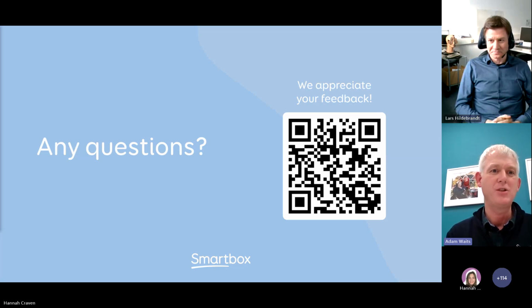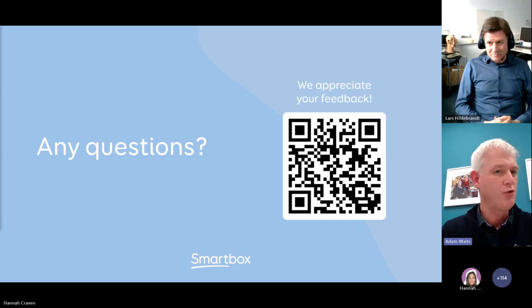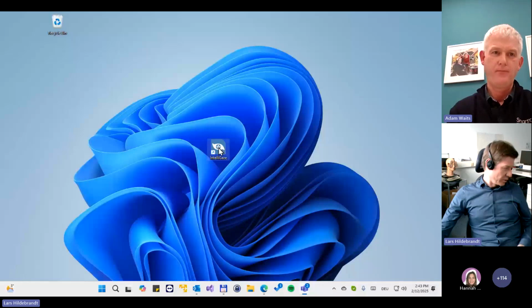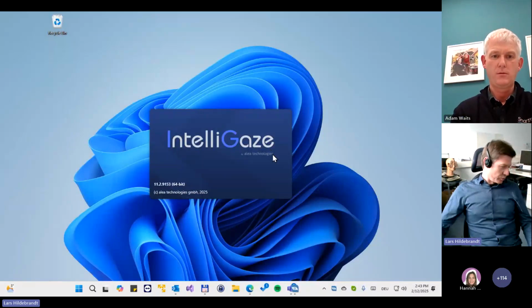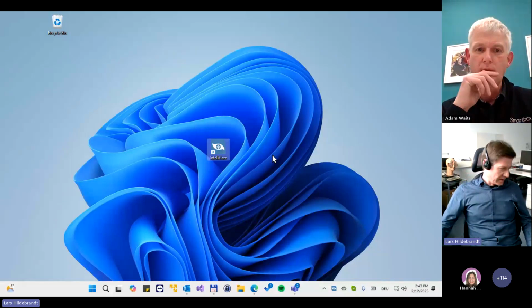Yes. It might be returned to demo in some cases, but I haven't got them all, but I'll try and cover most. So there was a question about the dwell mouse options, or what I think you would call live mouse. So dwelling, and you might use that, I guess, for say drawing or for gameplay, but that feature's just available within the options of IntelliGaze. No, you can, or the user can switch to live mouse whenever he or she wants at any time. You just go to the home menu and switch to live rather than the point and click method.